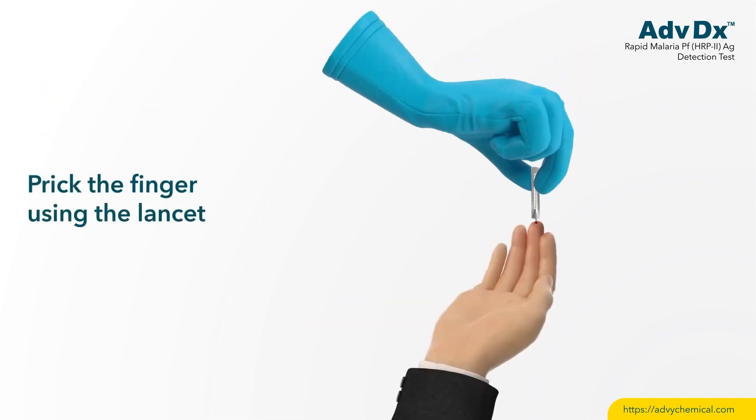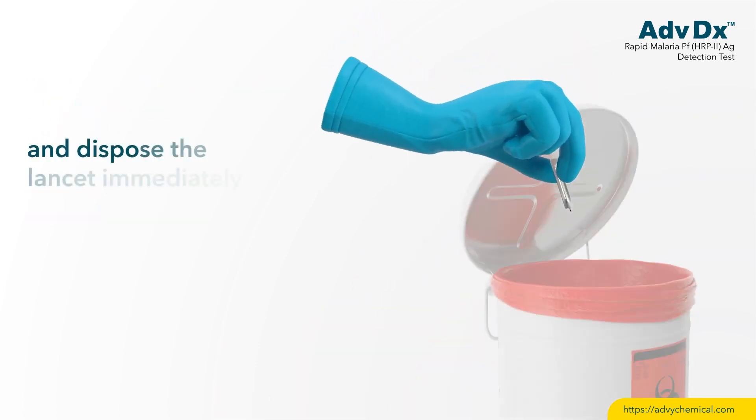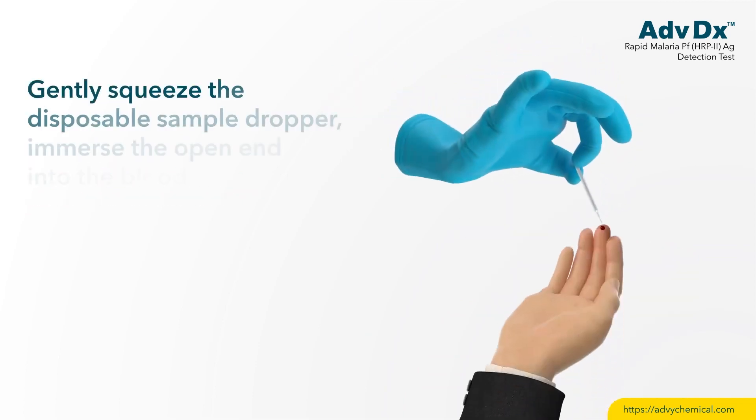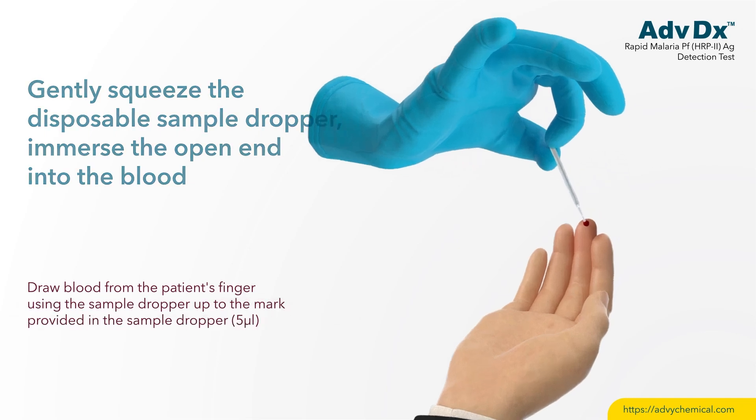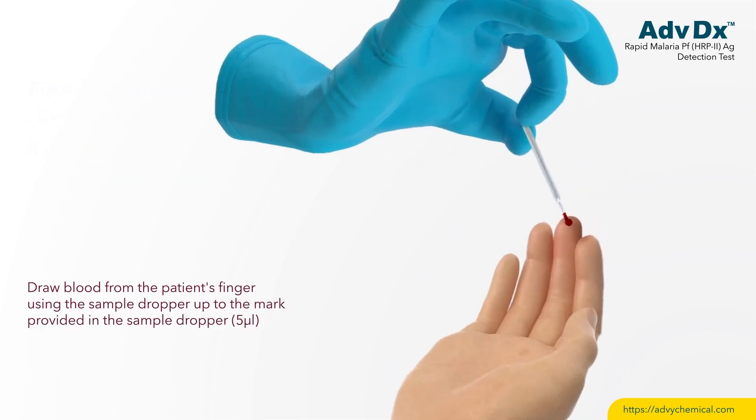Prick the finger using the lancet and dispose of the lancet immediately. Gently squeeze the disposable sample dropper, immerse the open end into the blood, and draw blood from the patient's finger up to the mark provided in the sample dropper.